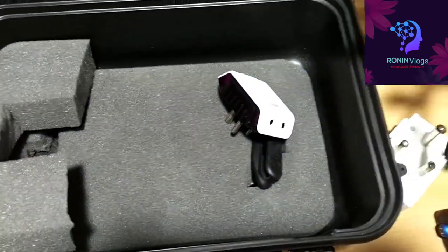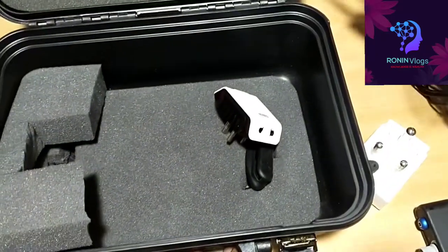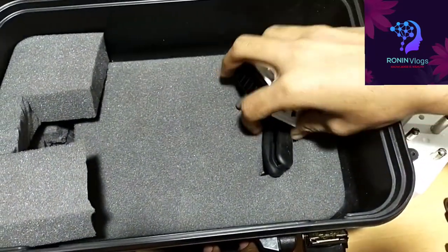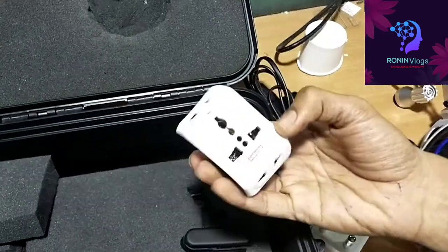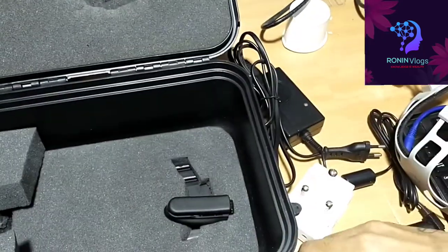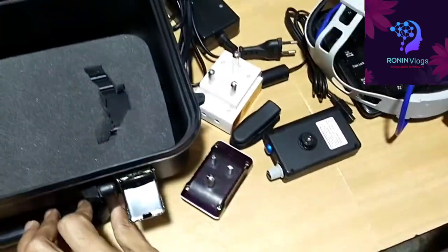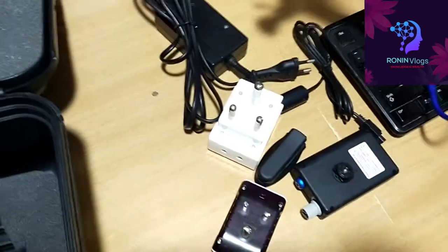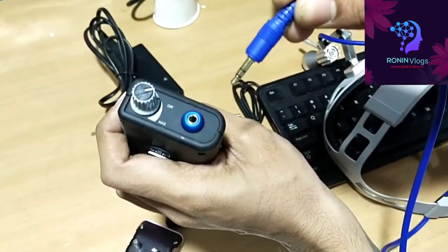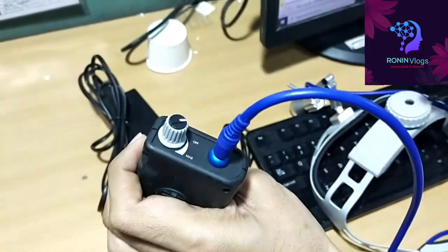This is the adapter and this is the holder. During surgery time, this will connect and the battery will hold. This is a connector where the headband connects to the battery.